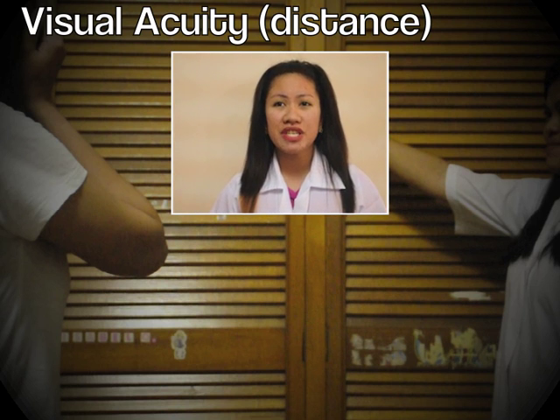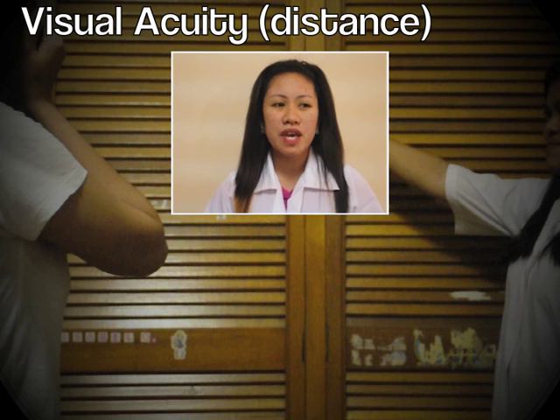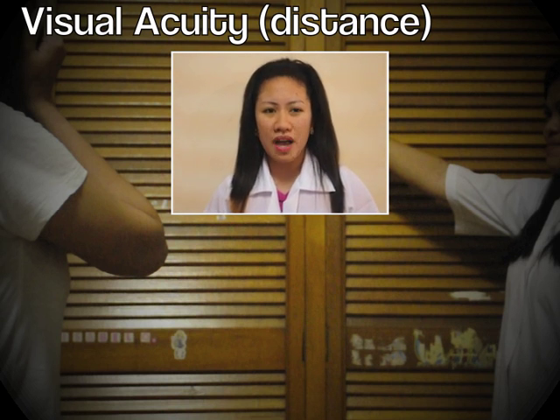Lastly, let the patient read letters without correction on the Snellen chart, corresponding with 20/20 in the left eye, 20/20 in the right eye, and both eyes.